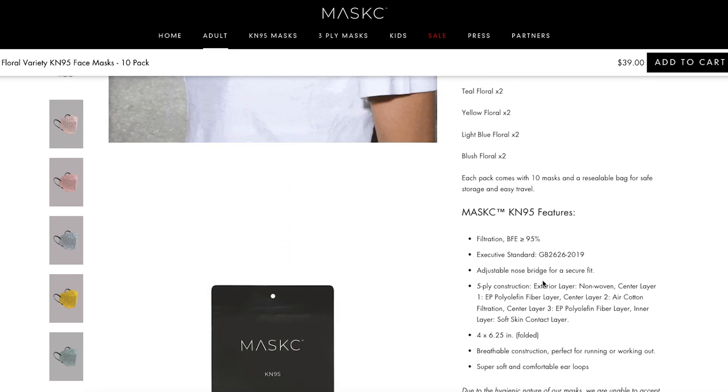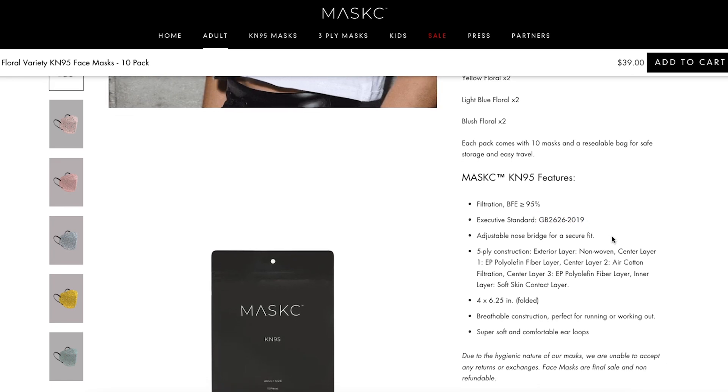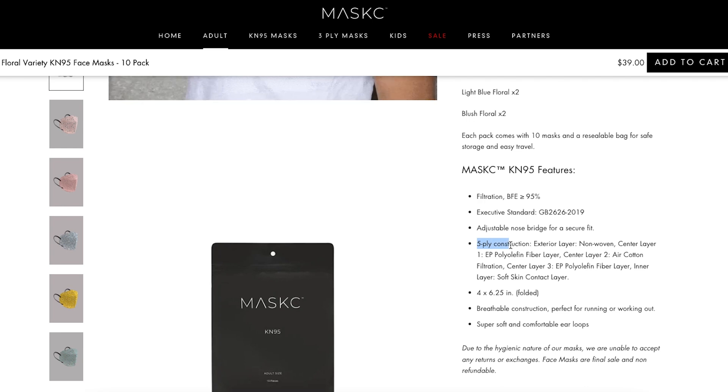If you scroll down, you can see the different prints as well as the standard that they follow. They follow the GB2626 2019 standard. It also states that these are a five layer mask and that they are perfect for running or working out.